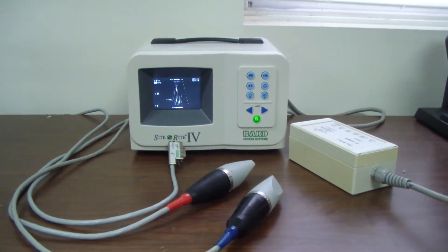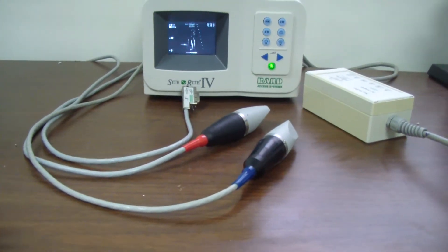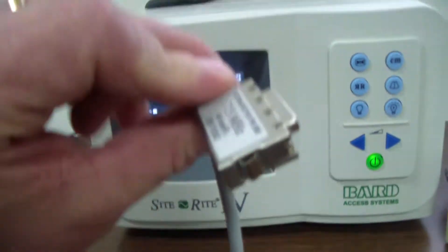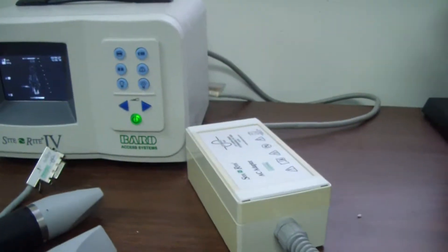Hey, it's DCSP Medical. Today we're looking at a BARD SightWrite 4 scanner. It comes with two scan heads — a 9 and a 7.5. The 9 is currently hooked up. It also has the battery AC adapter with it.